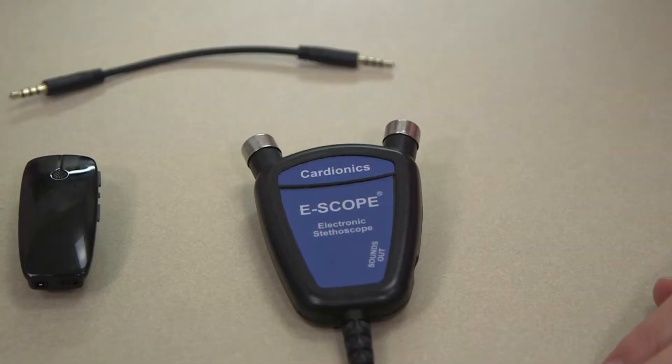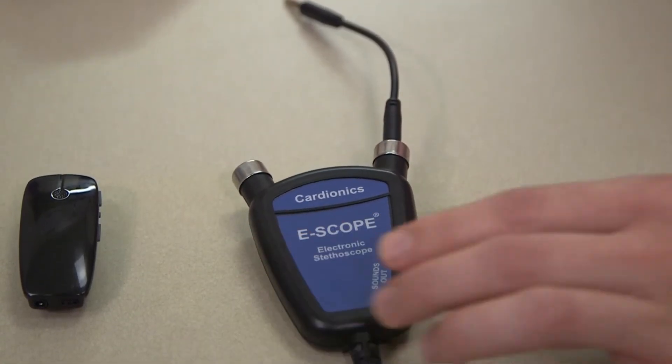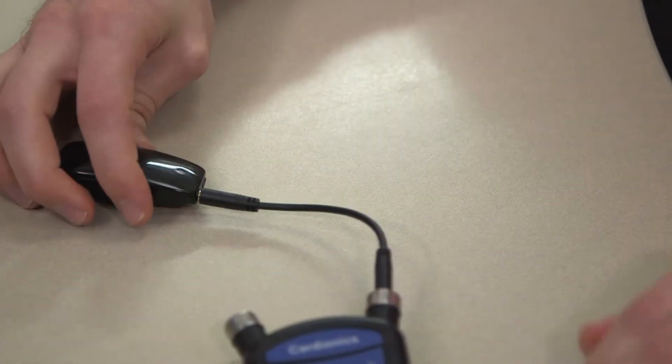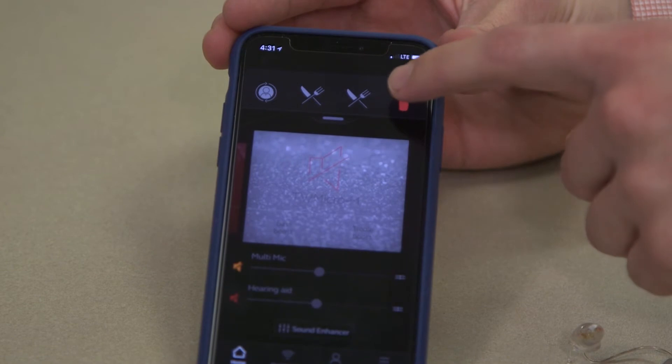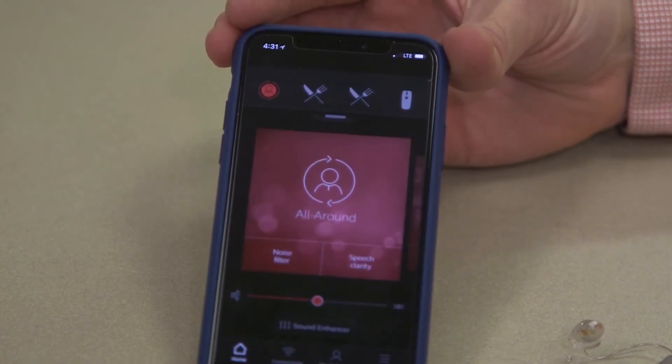This is really helpful for medical professionals who need to be able to listen to heartbeats throughout their everyday life. The way that we get it connected is using this audio-to-audio cord from the Bluetooth stethoscope to the multi-mic, then having the hearing aids or the phone switch into that multi-mic mode. There are a few ways to have that set up.